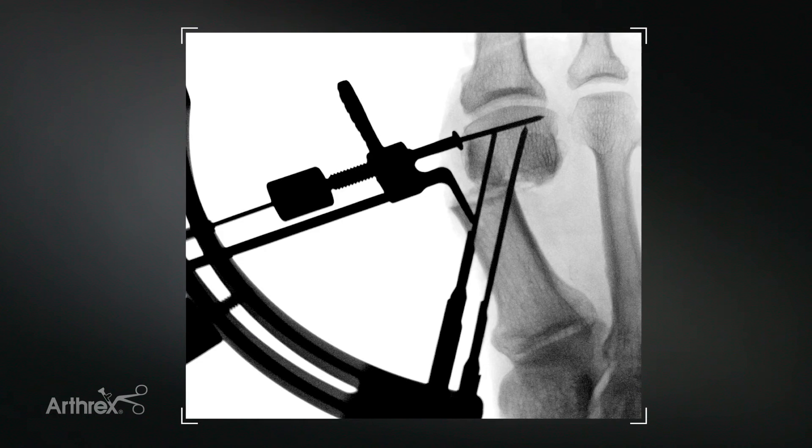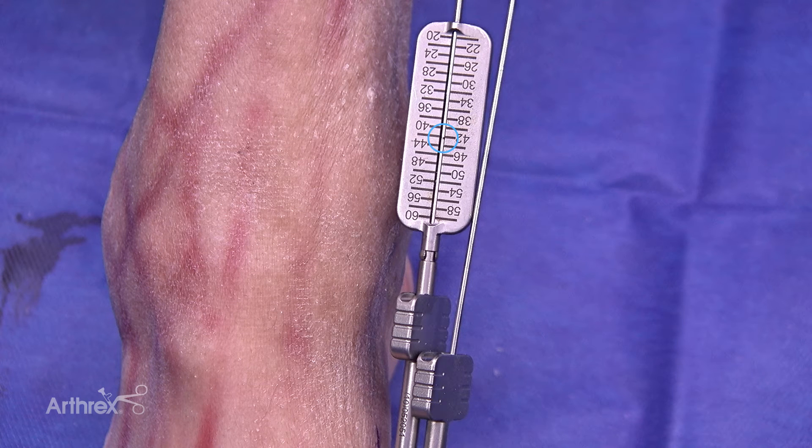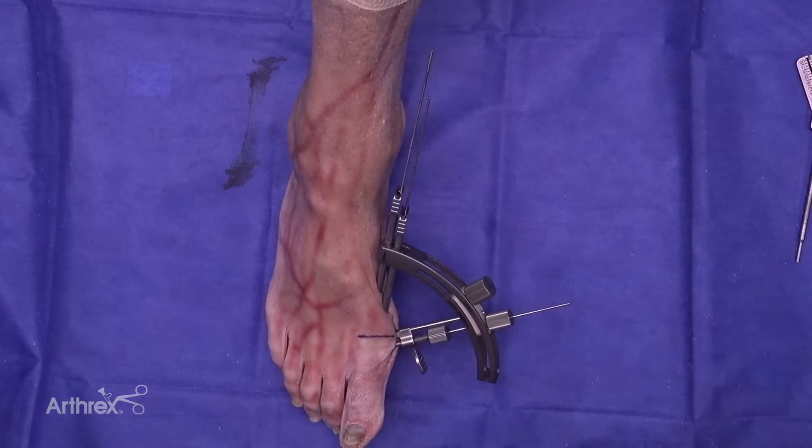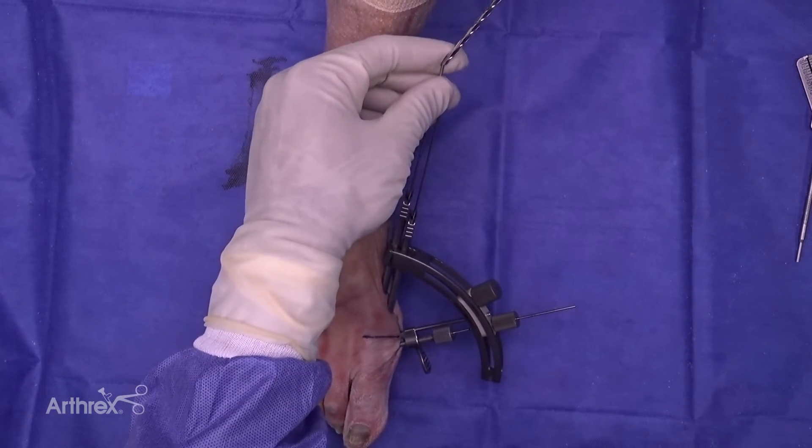On this image, you can see the parallel spread and adequate fixation needed to complete the correction. An important thing to always make sure is you are taking your lateral view prior to finalizing fixation to make sure that the capital fragment has been engaged. As you can see, we have a built-in depth gauge and in this case it is 42. We will repeat the same step for the distal screw. With the wire sleeves removed, you can proceed with drilling. Always drill the proximal one first.